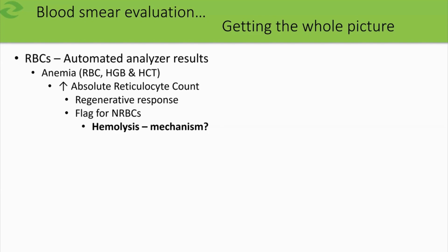But what specific mechanism are we talking about? Can the automated analyzer actually provide an answer? Not really. So it's time for blood smear evaluation.